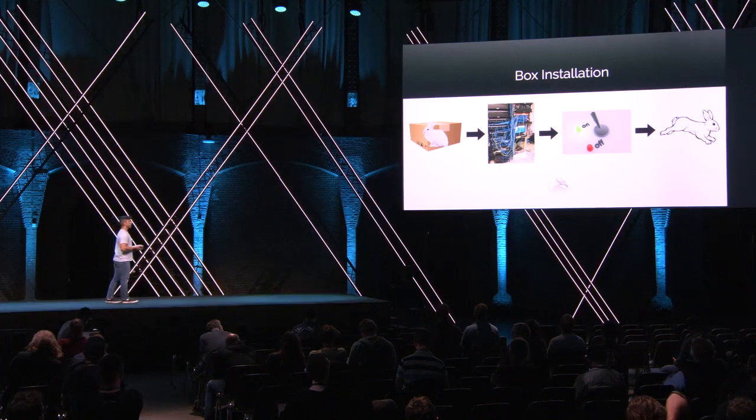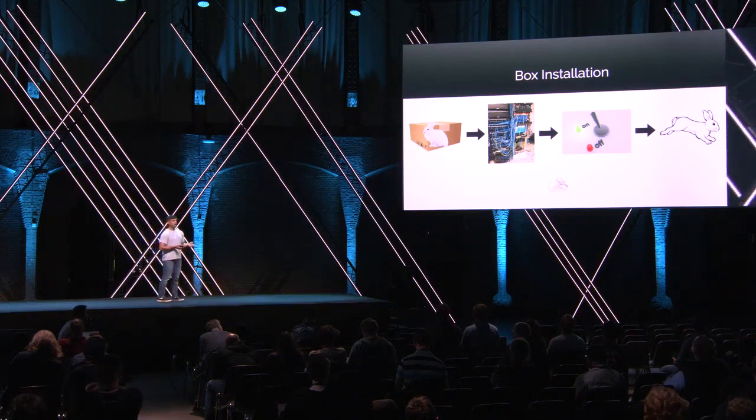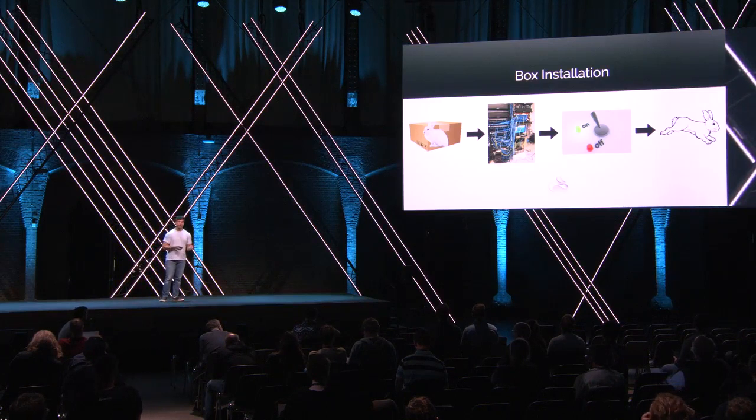We'll add a specific label to this node saying it's a clinic, and then immediately the Swarm scheduler is smart enough to schedule the RTR containers onto it as well. So it could be a potentially very manual bootstrapping process. With the power of Packer and a lot of automation, it can happen in 10 minutes, 20 minutes, mostly dependent on the bandwidth you have available at the clinic.